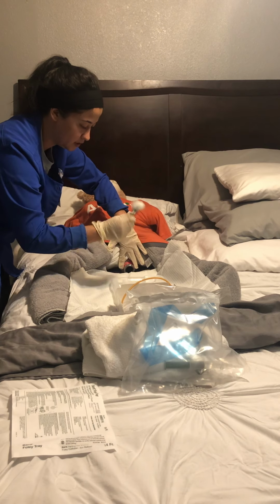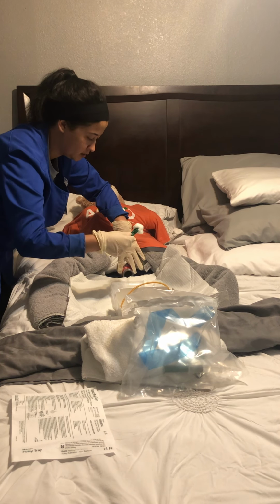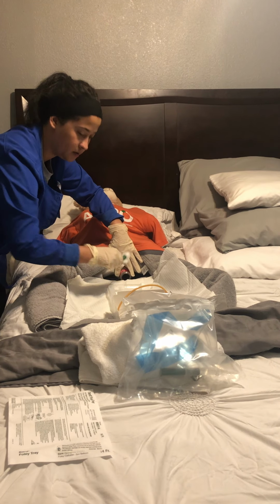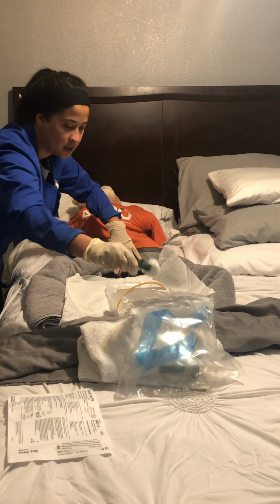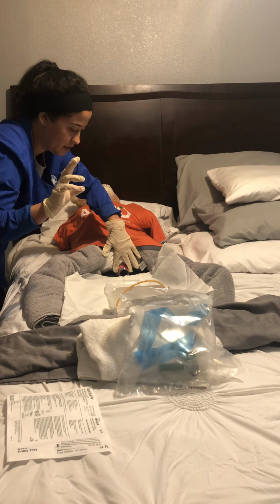and I'm going to start cleaning with the side furthest from me. So I'm going to go swipe down, discard the side near me, swipe down, discard. I'm going to go down the middle, discard, and with the rest of the cotton balls, I'm going to continue cleaning, exposing the meatus. Discard, and with my last one, I'm going to discard that.